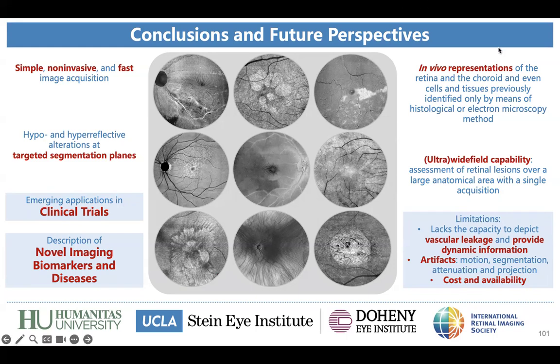Yes, I think that we have to learn, such as we learn English and learn how to analyze retinal imaging. I think that we have to learn how to talk with the artificial intelligence to get the results we are expecting.